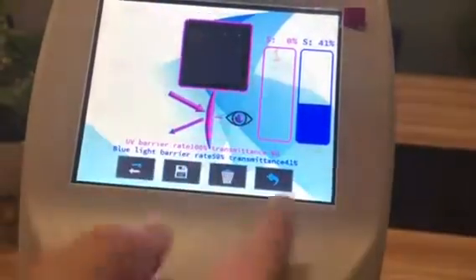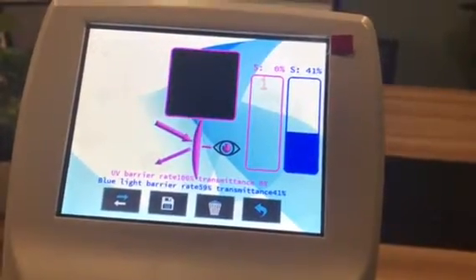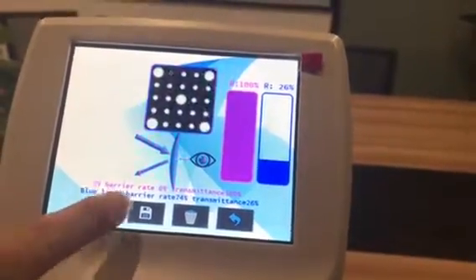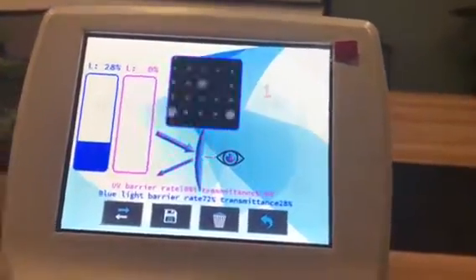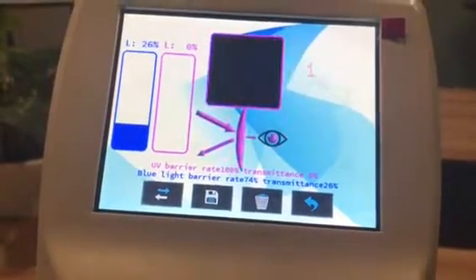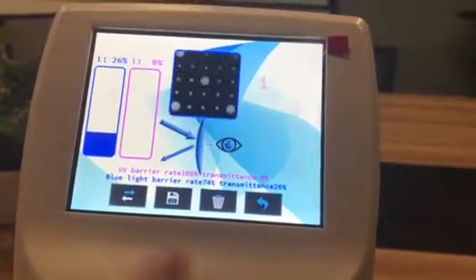So this is the right lens. Now, as you can see, it reads a transmittance rate of about 40% for the anti-Blu-ray rate. So we go to the left. Now the transmittance rate is about 26%. So it has all of the values you need for the Blu-ray transmittance rate.